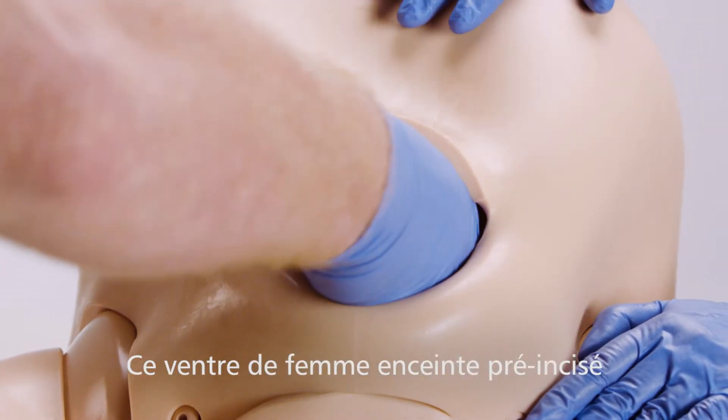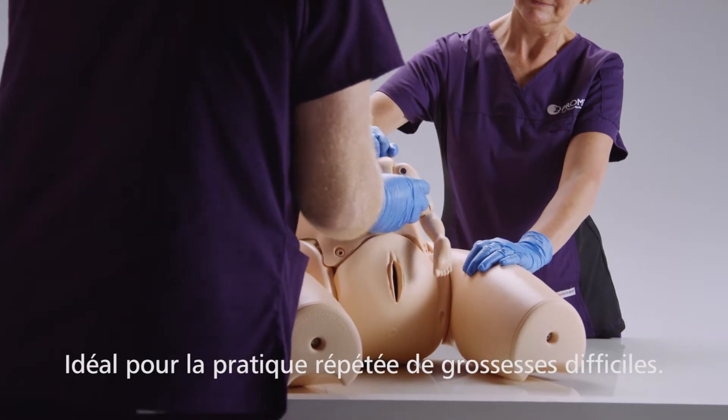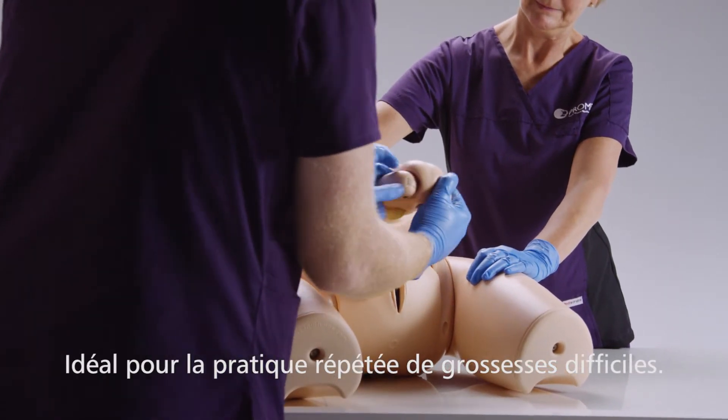The pre-incised delivery skin provides a durable and realistic full-term abdomen, making it ideal for repeat practice of difficult deliveries.